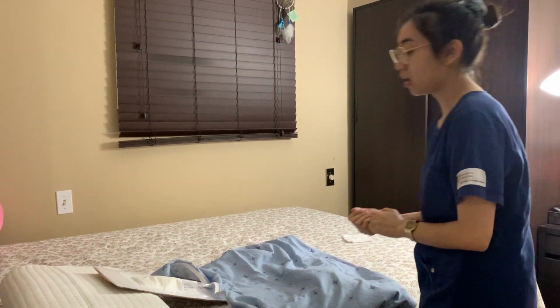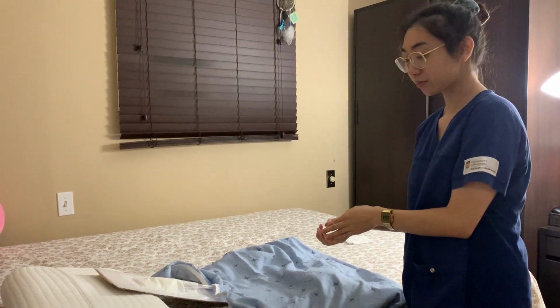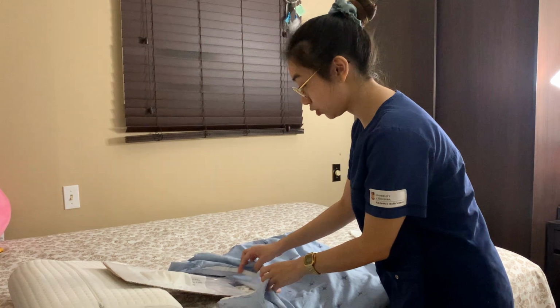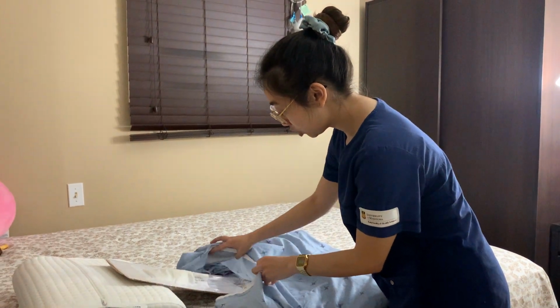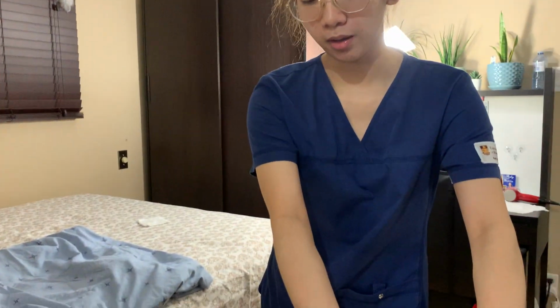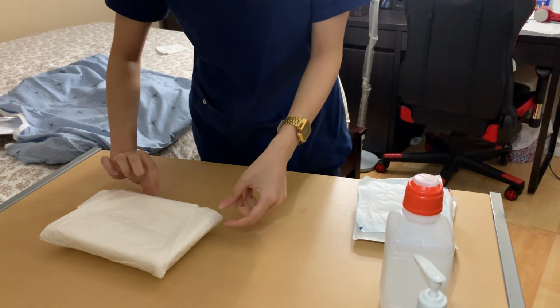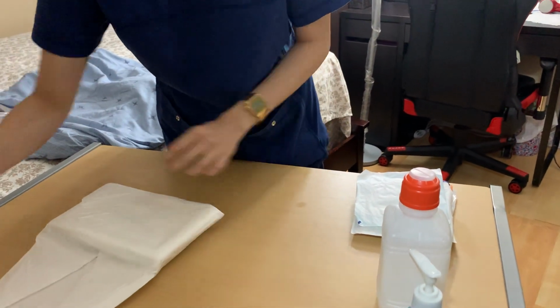Yes? Okay, perfect. So before I open my sterile fluid, I just want to make sure that my chest tube has no kinks and that it is draining well, which it is. That's good. Okay, now I'm going to open my sterile tray. Do my hand hygiene first. I'm just going to open the flap now.